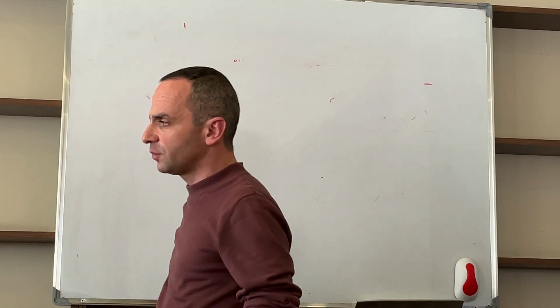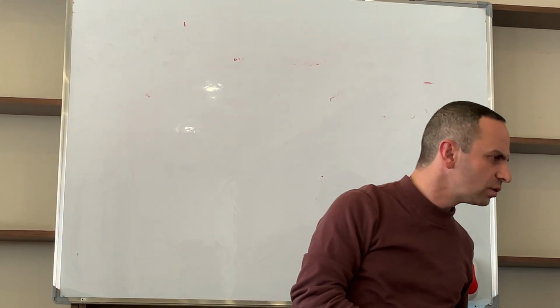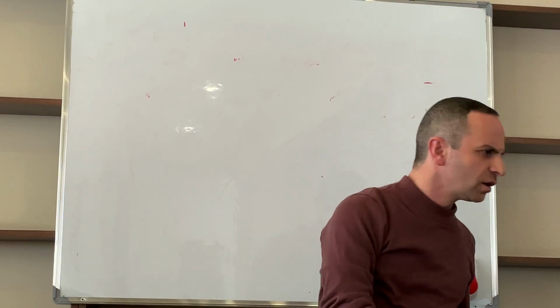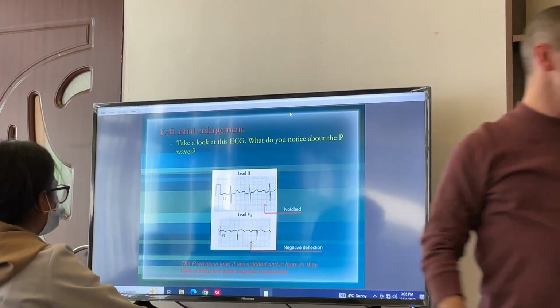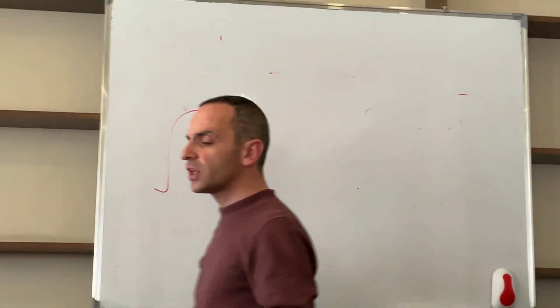If we are attentive, before each ECG starts there is a standard calibration. Before each ECG starts, we have such a kind of sign. It is like the Greek capital letter, like this, and it is called millivolt. What is this? It is for calibration.